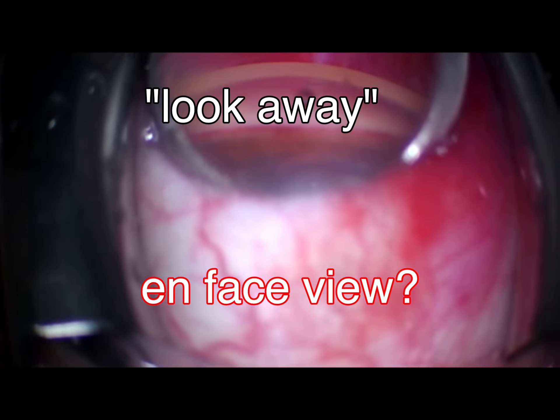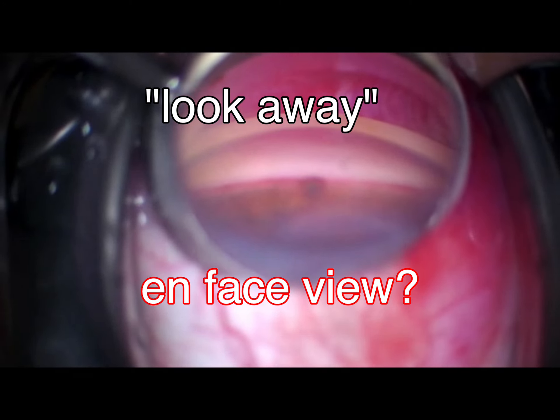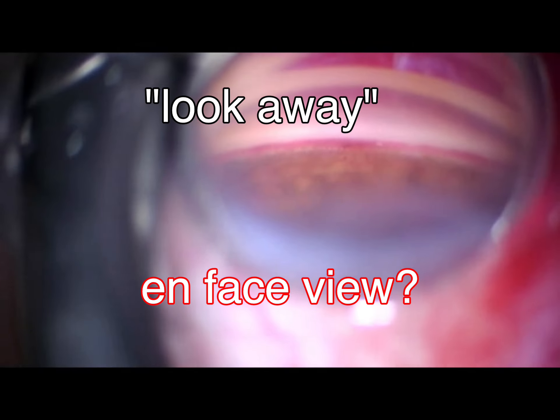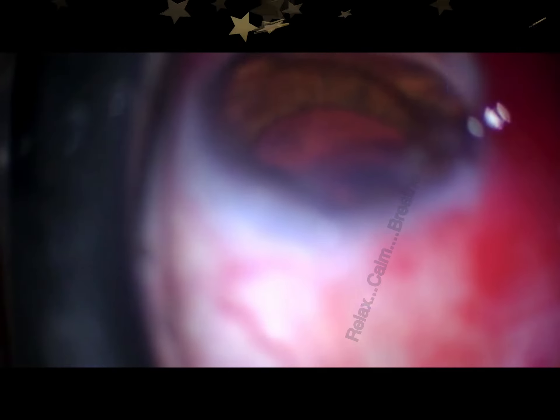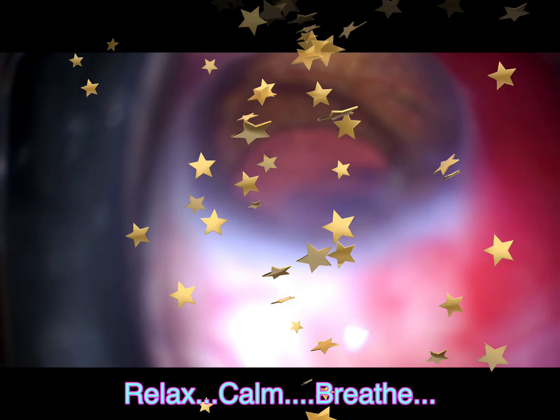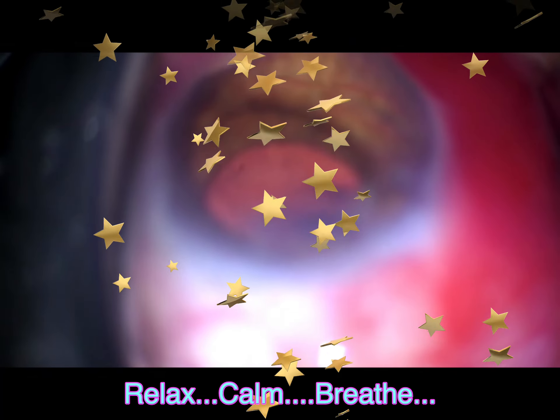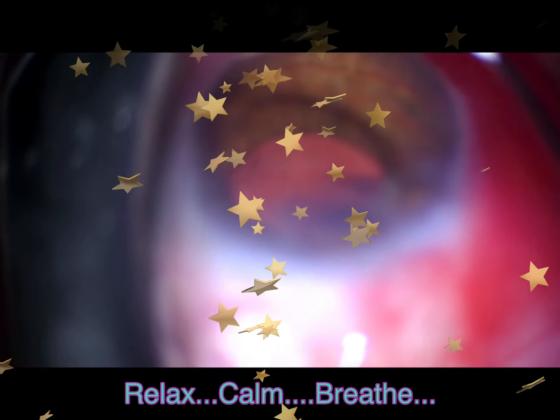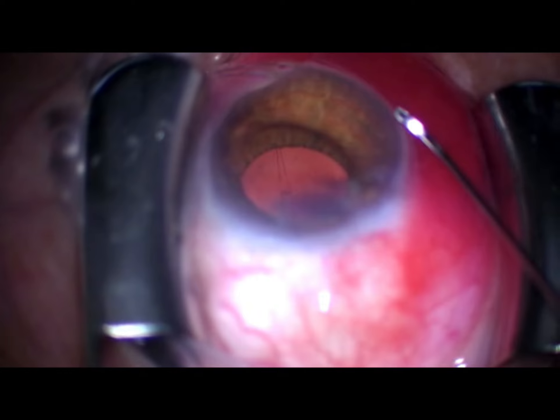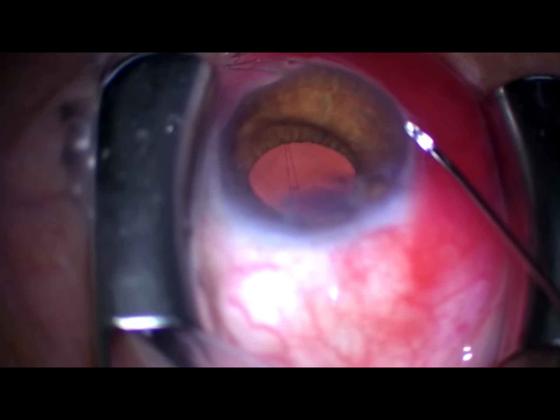I've got my en face view coming up, telling the patient to look away, making sure I'm really straight on to that meshwork. I can't emphasize this enough — avoiding any kind of angle. The tendency is for the patient to want to turn back towards the microscope. As always, we've got to relax, calm down, breathe. You just have to get rid of the energy of the cataract surgery and really focus on what you're going to do at this stage.